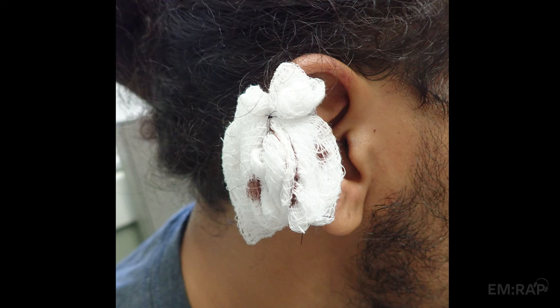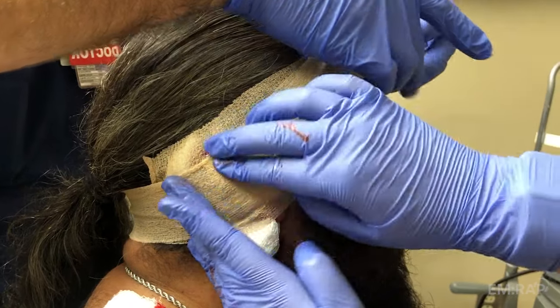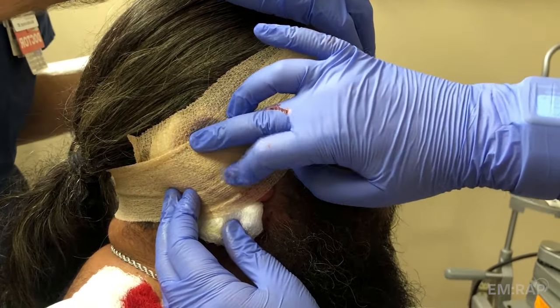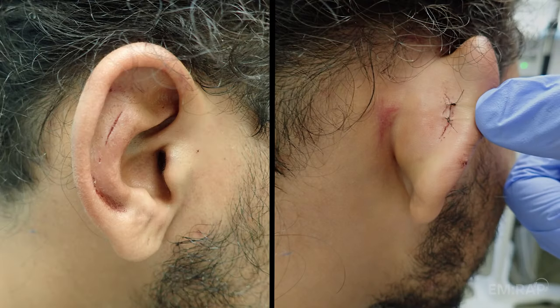Either way, the concept is the same: we're trying to maintain the normal shape of the ear while applying constant pressure to prevent reaccumulation of the hematoma. Whichever dressing you choose, it needs to stay in place for about seven days, then the patient can return to have it removed and rechecked. Here's an example of an ear bolster dressing that was sewn through and through that I happened to remove on recheck — and you can see it actually healed really nicely.